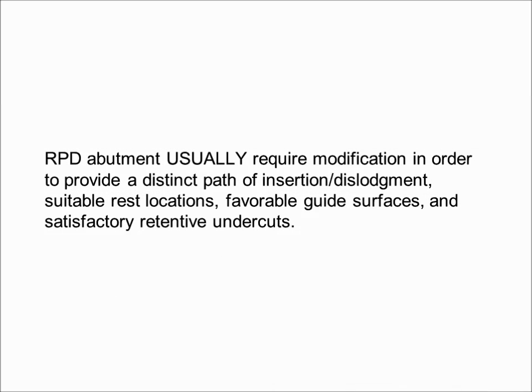RPD abutments usually require modification in order to provide a distinct path of insertion, suitable rest locations, favorable guide surfaces, and satisfactory retentive undercuts. These tooth modifications range from minor alteration of the tooth surface limited to enamel, to custom cast crowns.